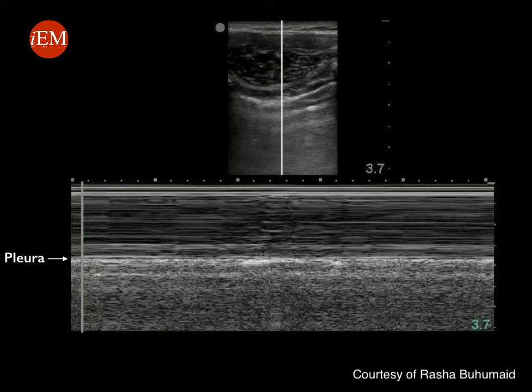Note that the upper part above the pleura shows no movement — there are straight lines. Just below the pleura, there is a motion artifact. This image is known as the seashore sign, which rules out pneumothorax.